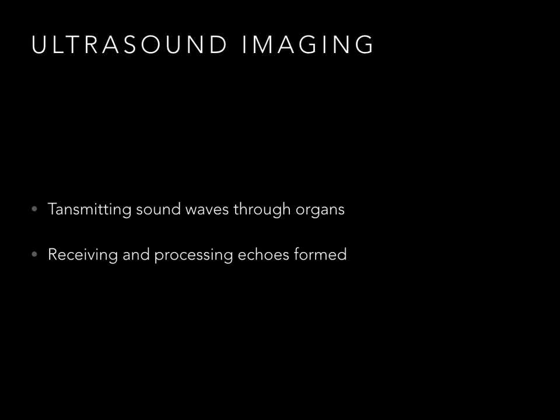In a nutshell, in medical ultrasound we're transmitting sound waves through various organs and tissues and then receive echoes. These echoes then are processed and displayed on a screen.